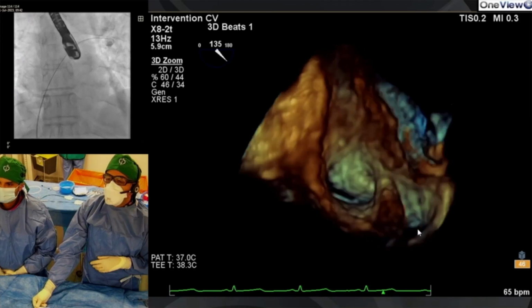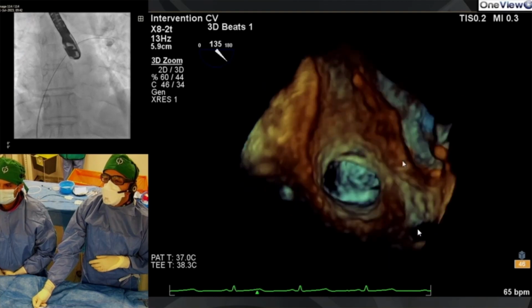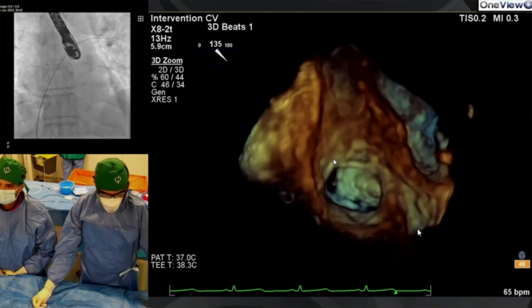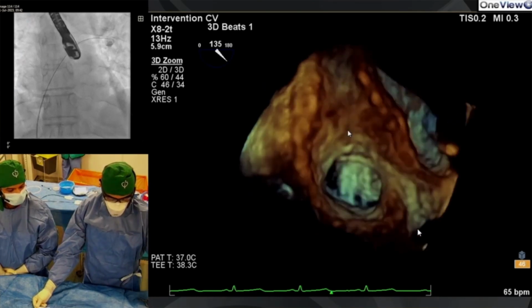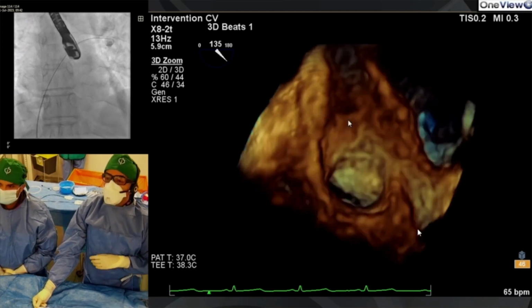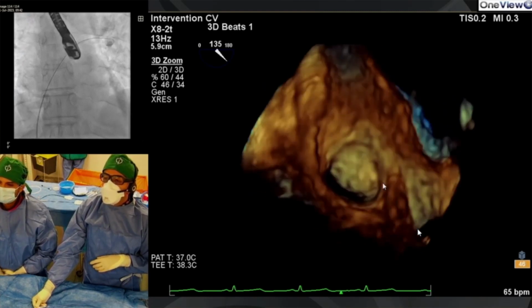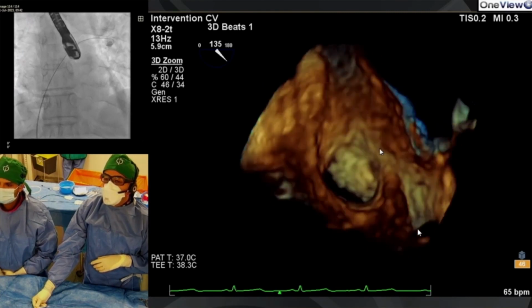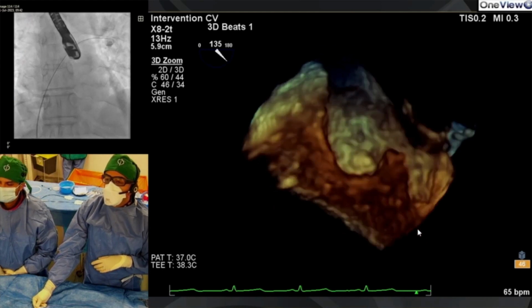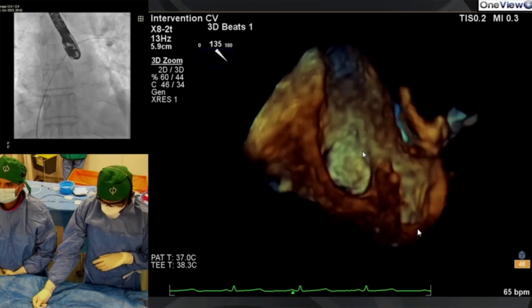And then now if we turn our attention to the atrial septum, now we have our landmarks. Well, let's have a look. So this is all atrial septum in front of us. Here very nicely demarcates the fossa ovalis, and you can see all of this thickened septum secundum tissue all the way around, which is quite prominent. The aorta is also quite prominent. It's a big structure in this atrial septum. And you can see this ridge coming up and attaching to the top here. And we saw that on the 0 degree view, which I will go back and show you in a second if we want to. But what's interesting is there's a fold of tissue here, which is that lip of tissue that I showed you on 2D.